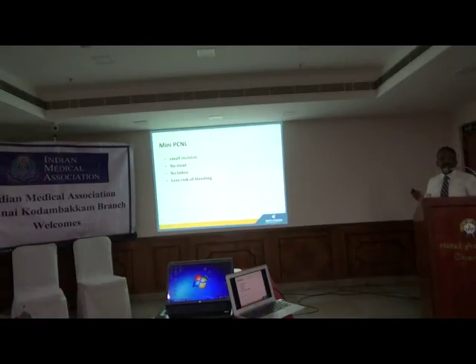So one of the biggest things in PCNL is, a few years back, we used to do PCNL with a sheath of about 26 or 28. So the chances of bleeding are very high, especially due to pseudoaneurysm or AV fistulas. This has changed in a big way by doing mini PCNL. Mini PCNL is the first step. What we do is use a smaller incision so that bleeding complications are much less, and it has gone further down to no stent, no tubes, and a lower risk of bleeding.